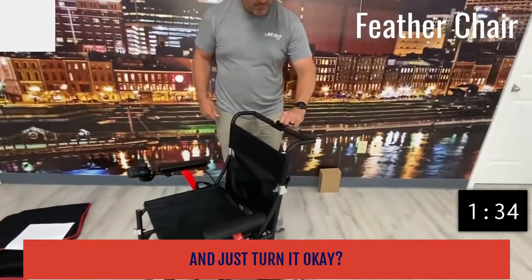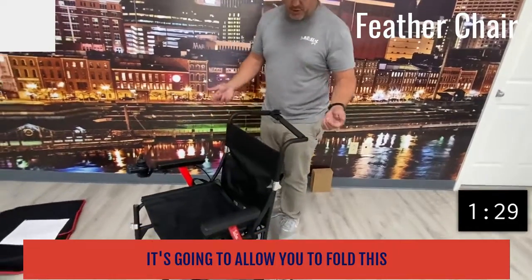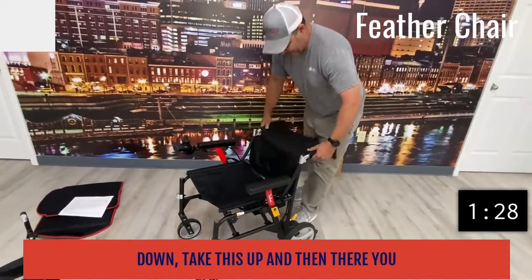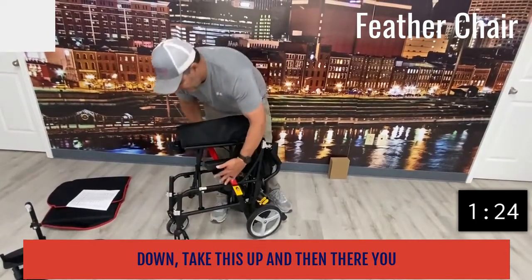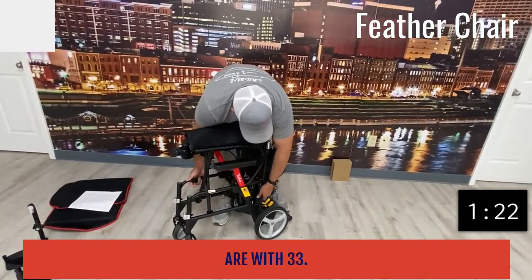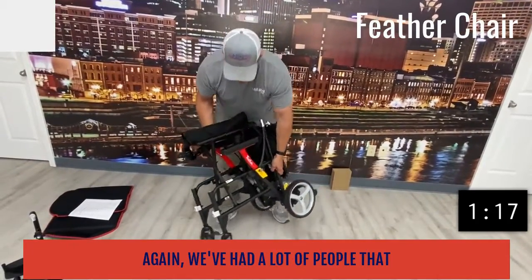You take this little device right here and just turn it, and just like a regular wheelchair it's going to allow you to fold this down. Take this up and there you are — 33 pounds. It's very lightweight.